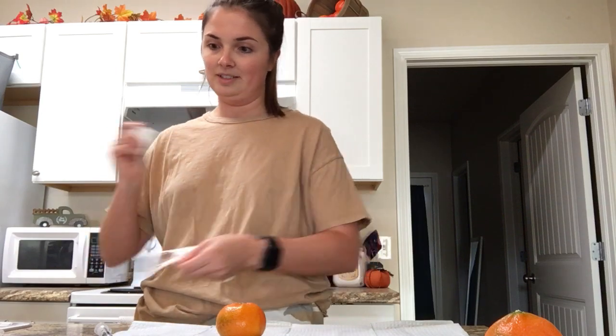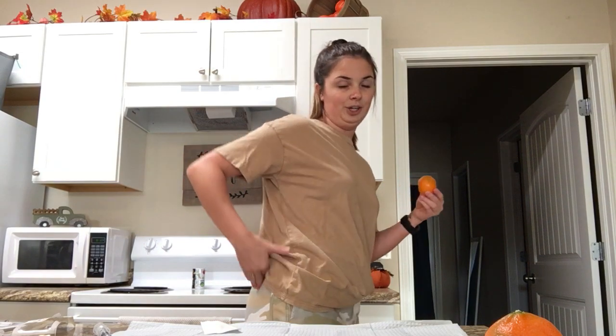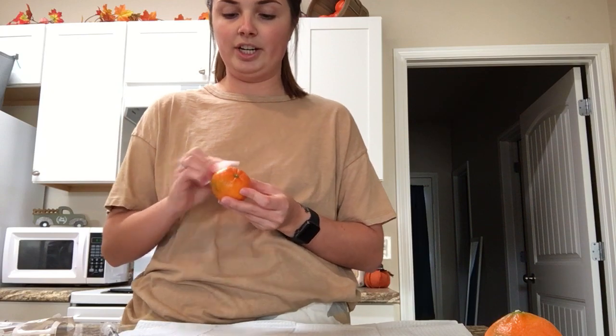I didn't see any in the lab bag, so I'm just going to pretend this is an alcohol wipe. So I wiped it open. So I'm going to clean the area that I'm going to inject into, either on the side of the glute or the middle part of the thigh in the 3 sections that we discussed. I'm going to wipe down, clean the area for about 20-30 seconds. Make sure I get it good and clean.